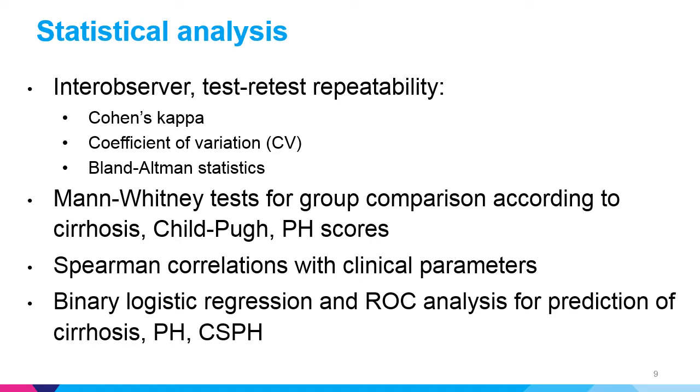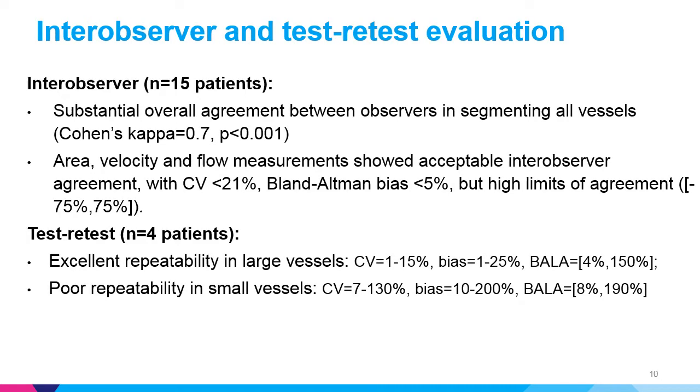For evaluation of the diagnostic performance of 4D flow parameters, we used binary logistic regression and ROC analysis for prediction of cirrhosis, PH, and clinically significant portal hypertension.